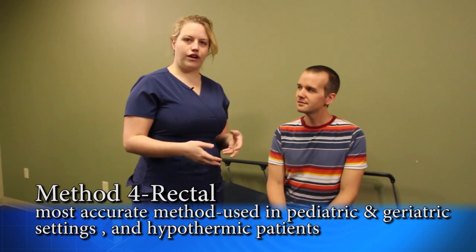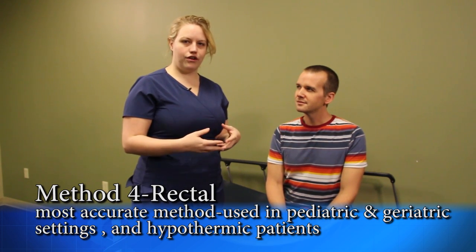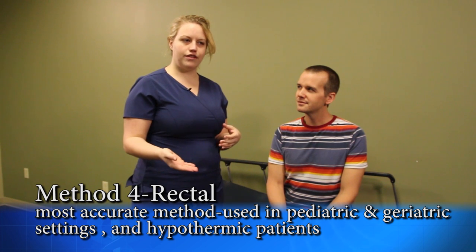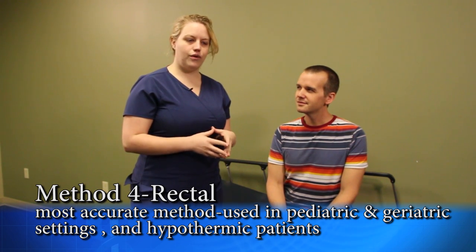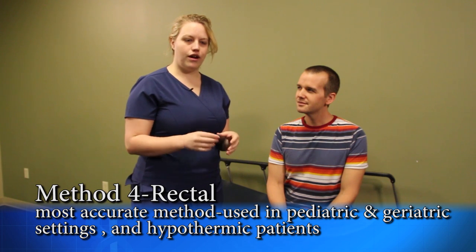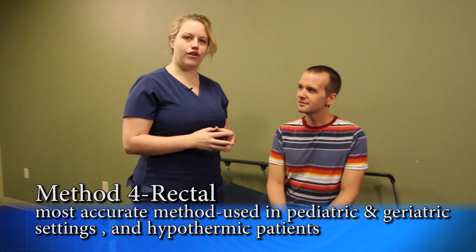Next there is the rectal temperature, which is our most accurate and is used in pediatric settings, geriatric settings, and also in hypothermic cases where an extremely accurate temperature is very vital.